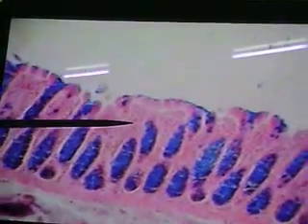About three or so of us were doing a course on research technique, and we were looking at staining reactions, and looking at mucus production, and noting all of these various mucopolysaccharides. Alright, so it's a very old slide, and I'm happy to see that the colors are still quite vibrant. So that's a nice slide of the colon.